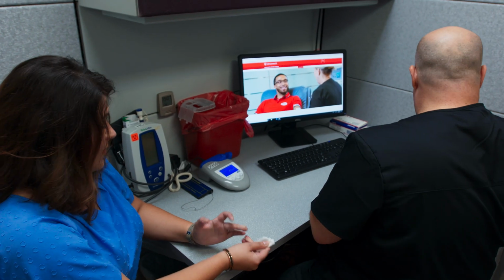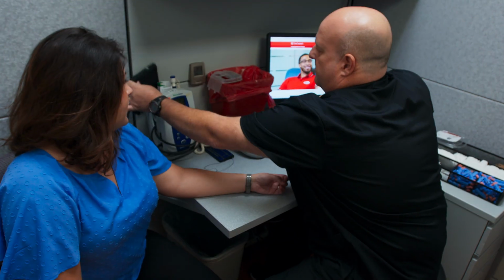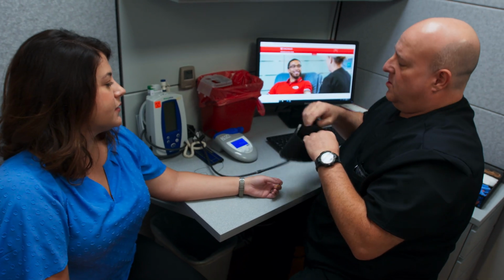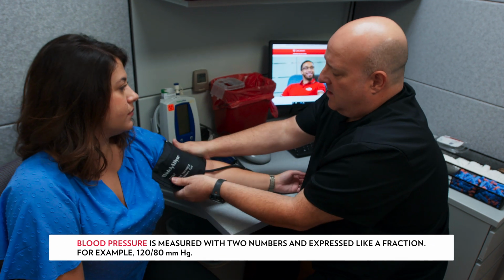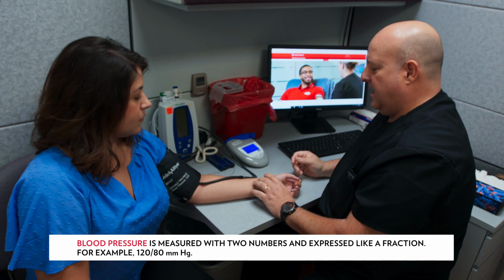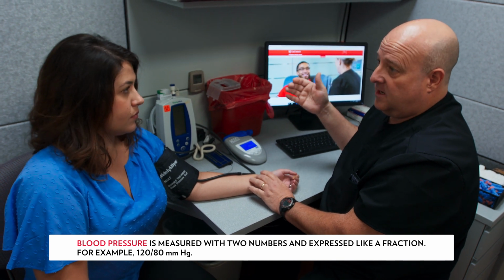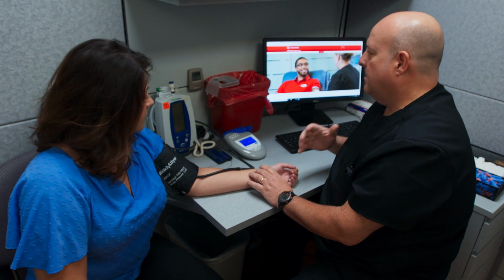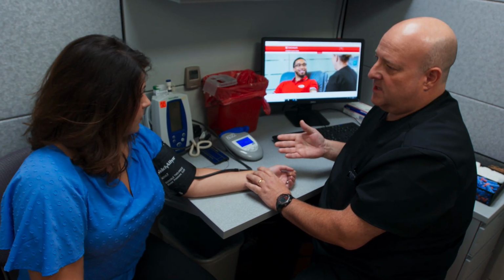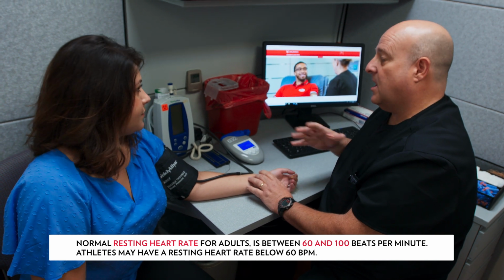All right, let's get a Band-Aid on your finger, and we'll get your blood pressure. So what's the healthy range for blood pressure to be a blood donor? So blood pressure, 120 over 80 is the baseline. The parameters that we have, you can't be over your higher number, can't be over 180, lower number below 50. Just a safety factor for you. We also check your pulse to make sure it's within range and not irregular. In case there would be something going on with you, we don't want to put you in a compromised position.